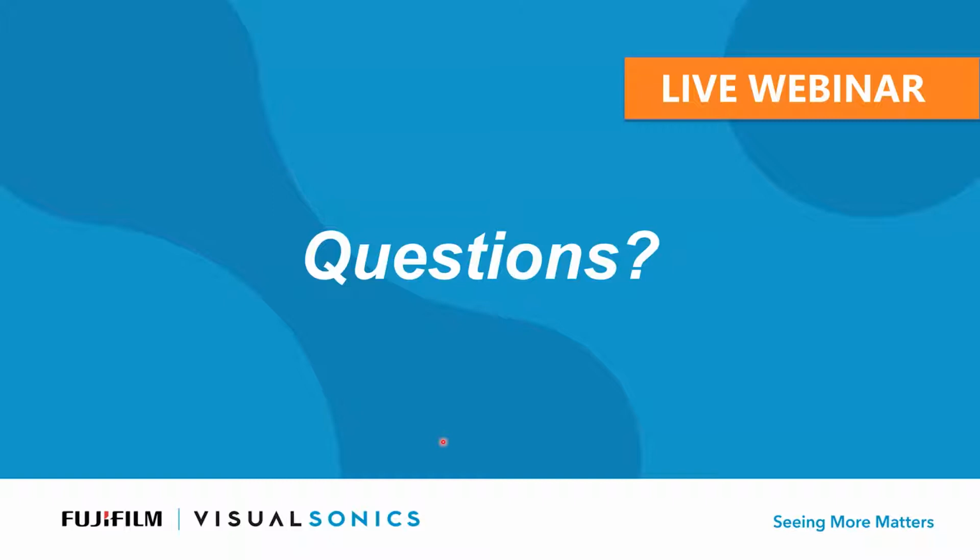So we have quite a few questions that are pouring in right now. Arvin, I know you said early on that you did the analysis for 4D on the short axis, but can this actually be done on the long axis, or do you have the potential to maybe acquire the image in a long axis, which would be a little shorter time frame for acquisition, and then rotate the image and do the analysis on the short axis?